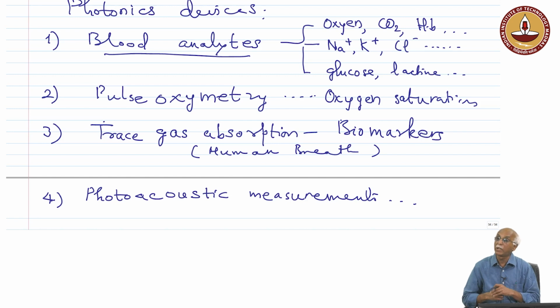So, it is very difficult to capture this information, but if we can induce photons getting absorbed and producing acoustic waves in the body, then it is very easy to capture acoustic signals. So, it is photoacoustic measurements.